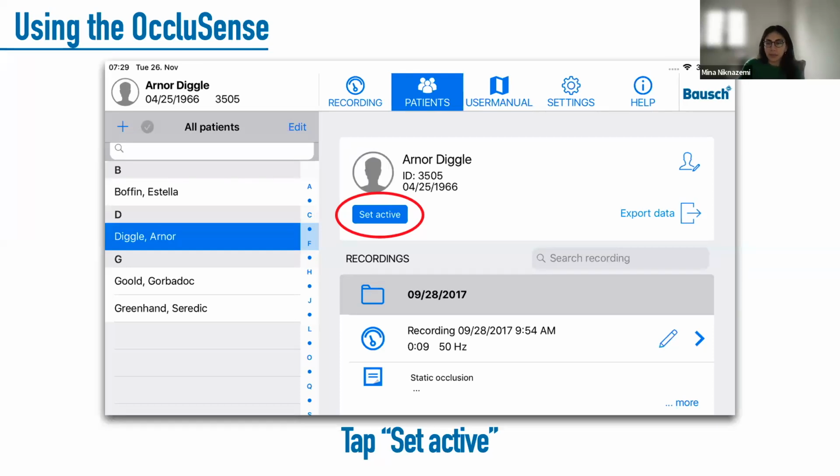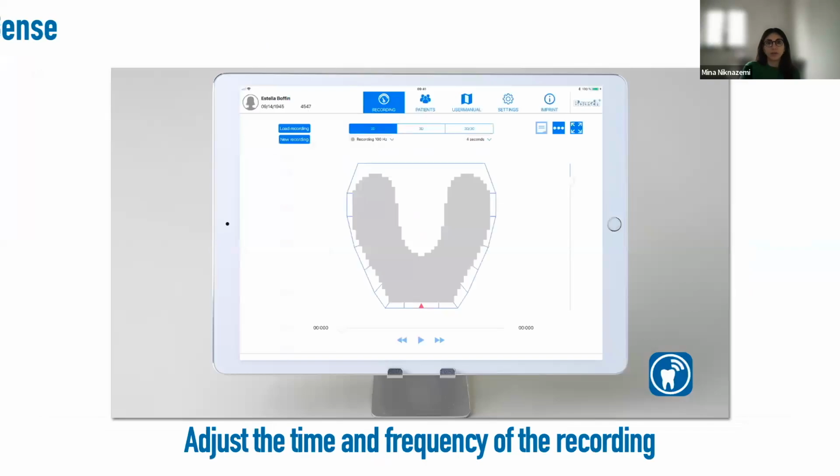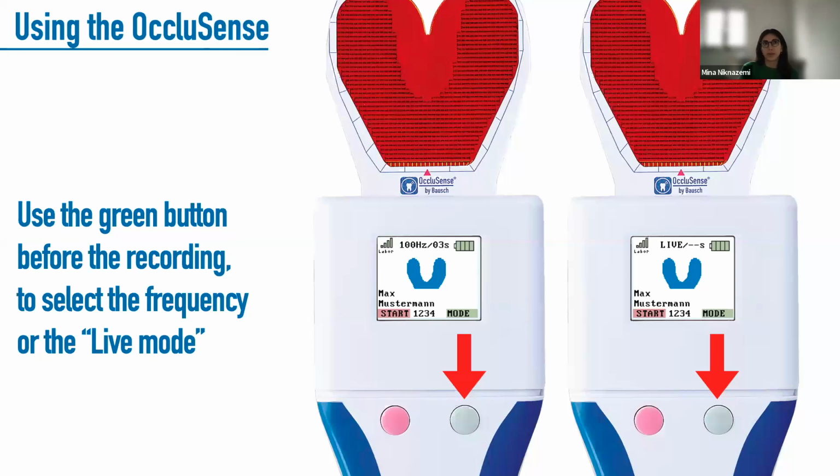You fill in the blanks, and once you've then added your patient to the database, you are able to activate them. Here we've used the patient that had already been added to the system, and you can also see their past recordings. You can scroll down, go on to new recording, and now you're ready to start a new recording. It will prompt you to adjust the time and the frequency of the recording. So for how many seconds do you want to record? How frequent are the pictures that are being taken? And once you have selected those, you can start.